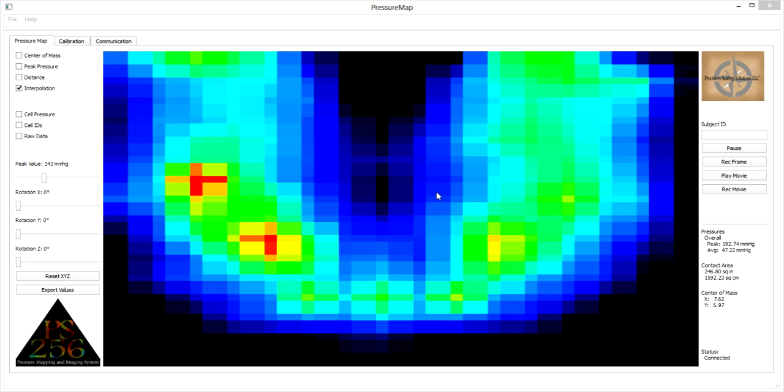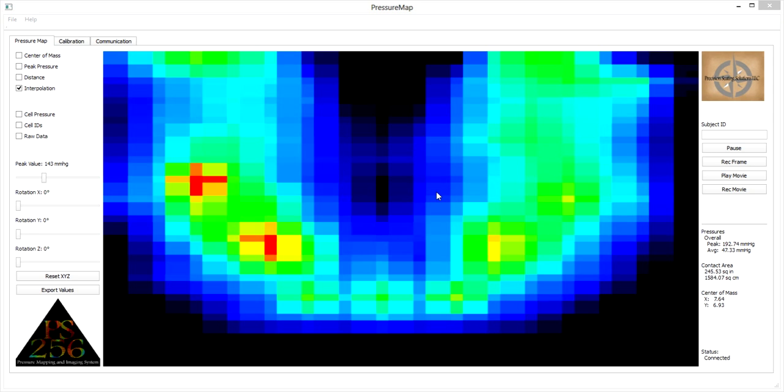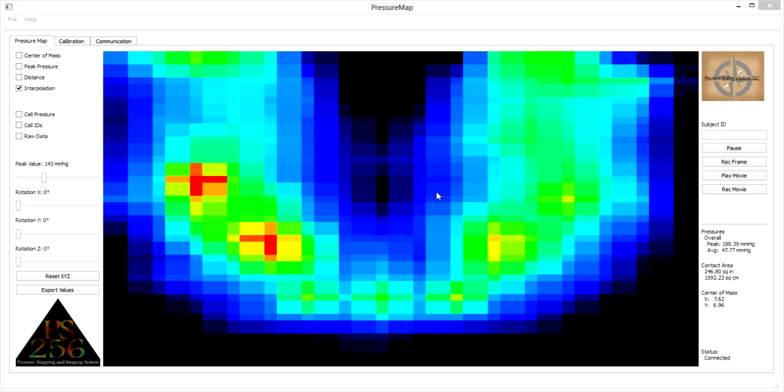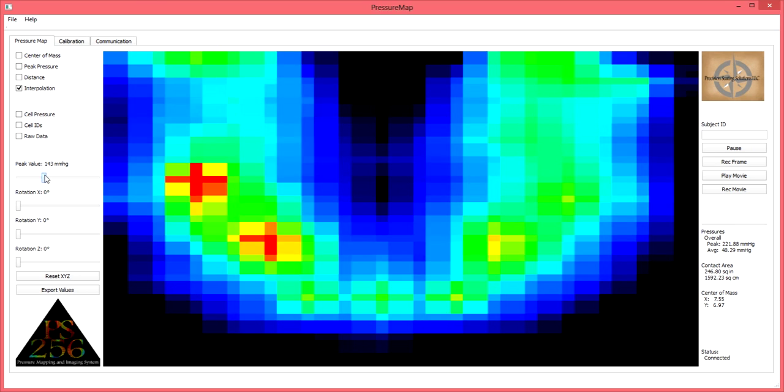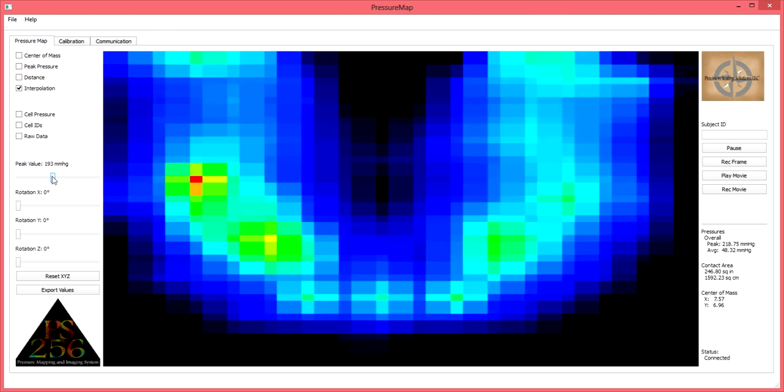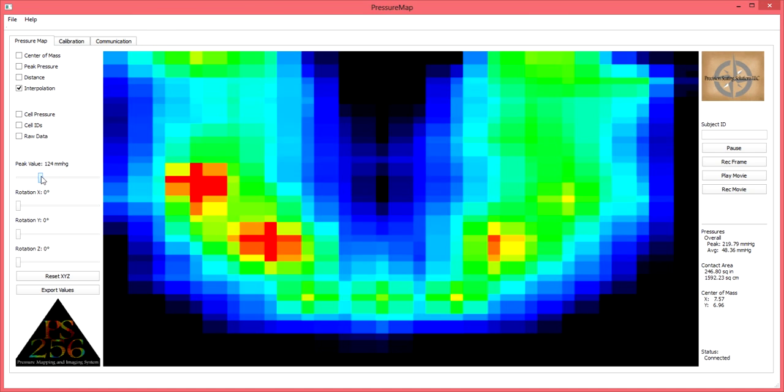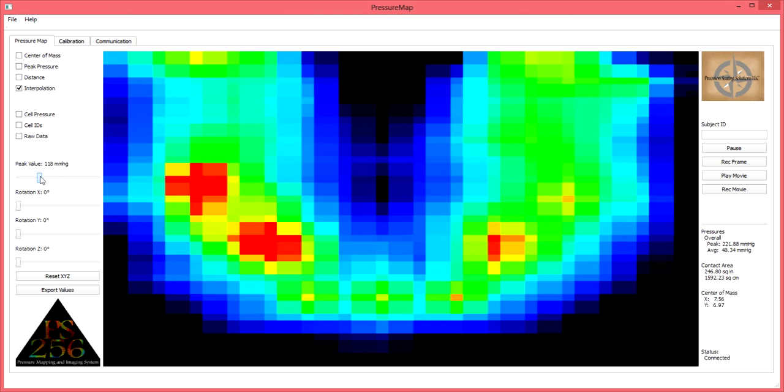Place the mat on the surface to be examined and set the client on top of the mat. When pressure is placed on top of the mat, a series of colors will present as you see here. Similar to Doppler radar as you would see on your local weather station, red and hotter colors indicate areas of higher pressure. Blue and other cooler colors indicate areas of lower pressure exertion.